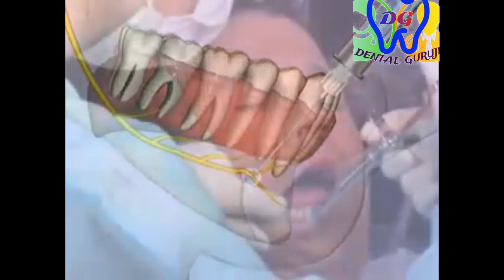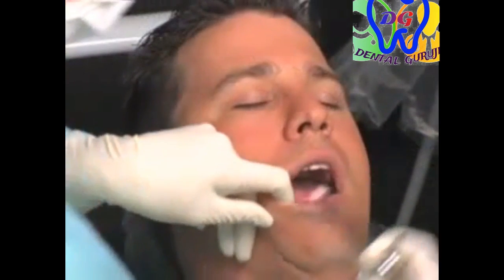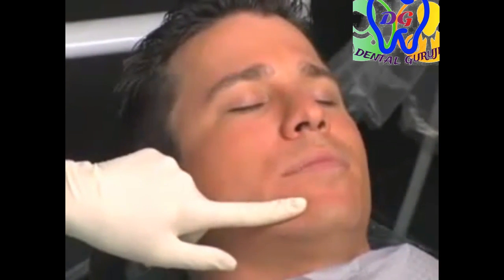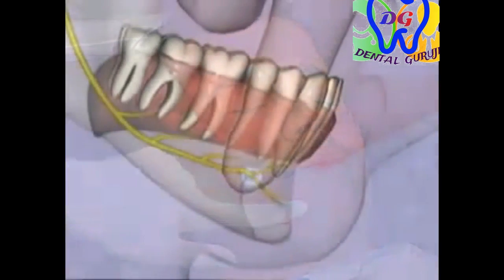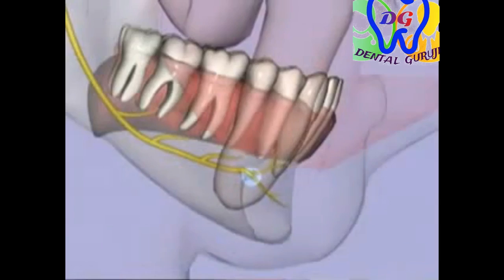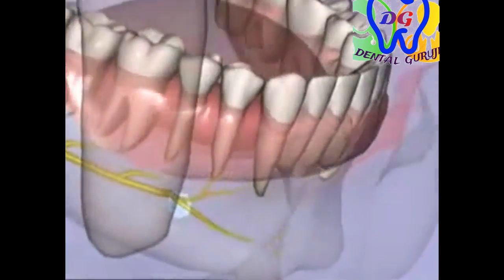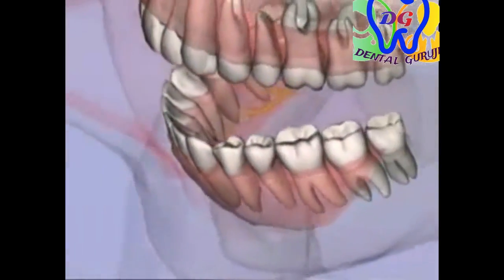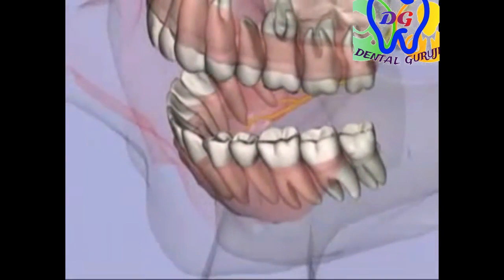The syringe is removed, and pressure is applied extra-orally or intra-orally, forcing local anesthetic into the mental foramen, blocking the incisive nerve.